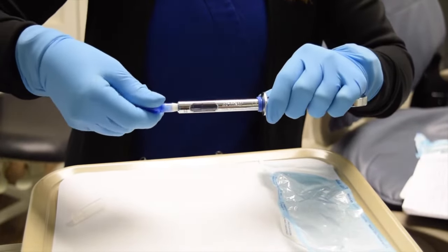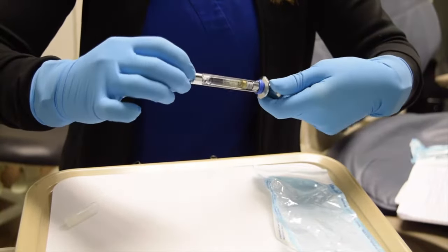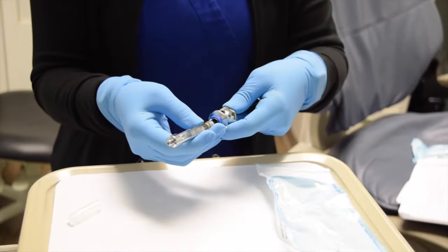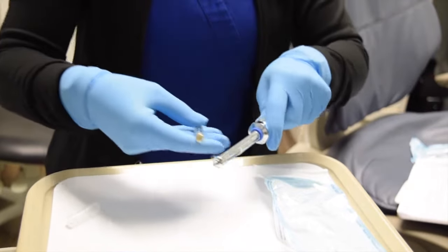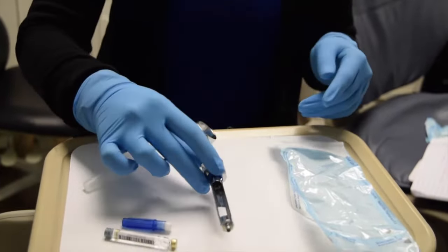Once you're done, you will first unscrew your needle, which will go into the sharps container. You'll pull back on the thumb ring, which will disengage the harpoon from the rubber stopper. Your carpule will also need to go into the sharps container, and your syringe will go into sterilization.